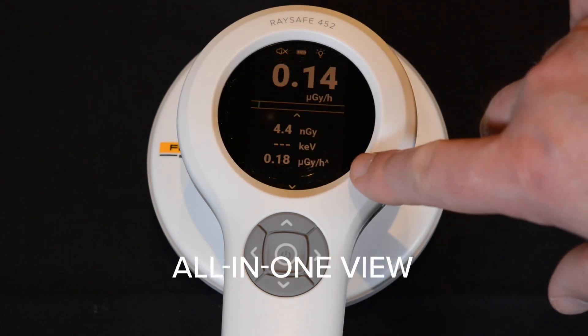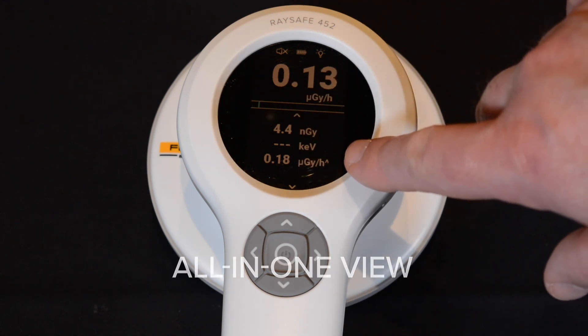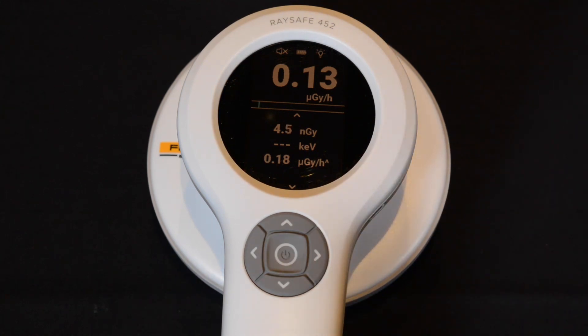When using other instruments, you might have several modes, but with the 452, you have everything all in one. There is no need to select anything. It's all automatic.